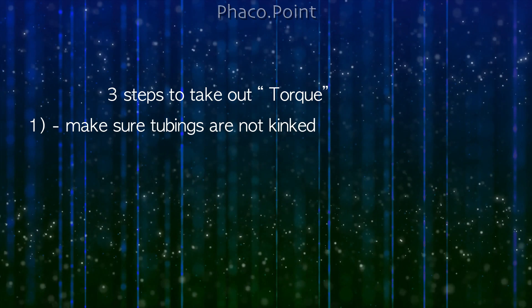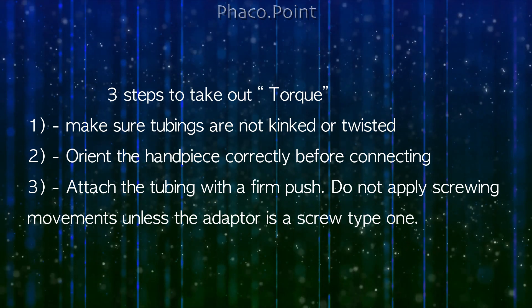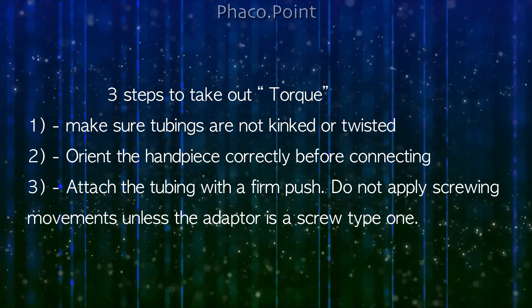The three steps to take out the torque: First, make sure tubings are not kinked or twisted. Second, orient the handpiece correctly before connecting. Third, attach the tubing with a firm push. Do not apply screwing or rotatory movements unless the adapter itself is a screw-type adapter.